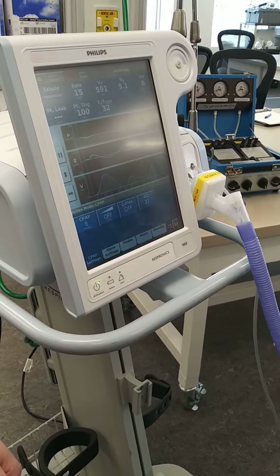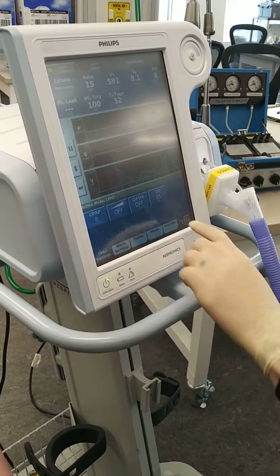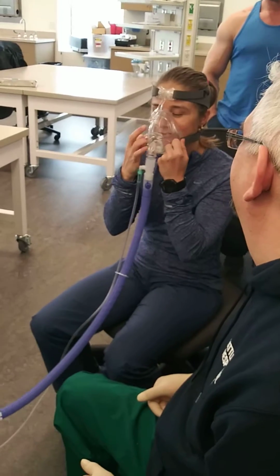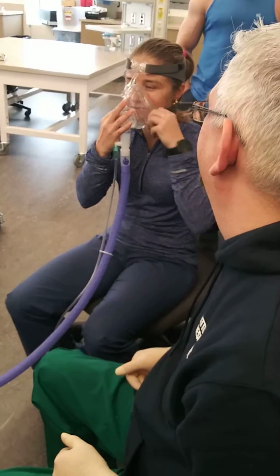And there you go. Beautiful. How fun. So mask comes off first. Stop.